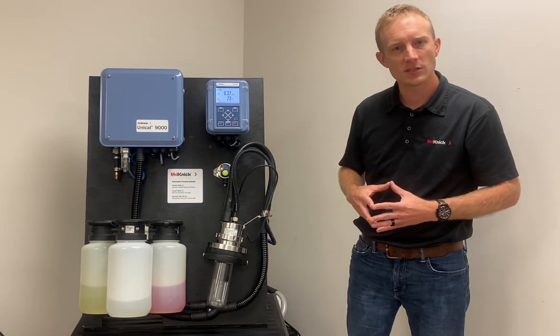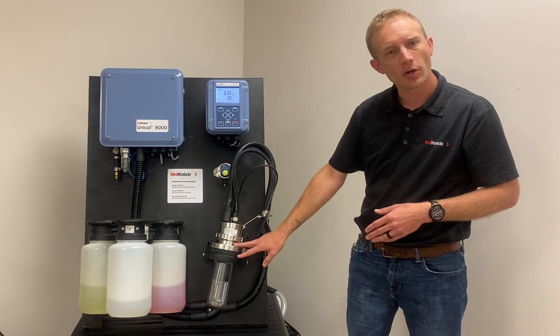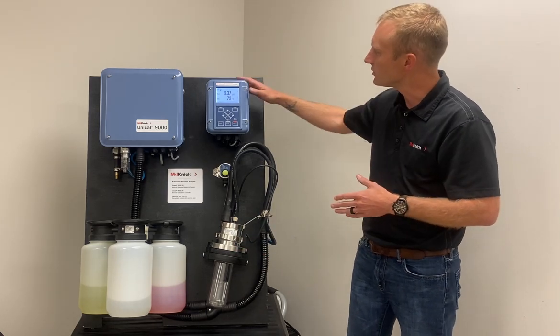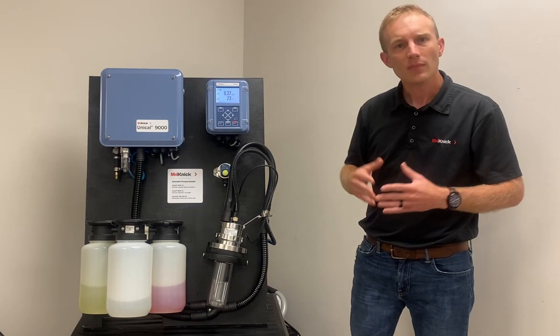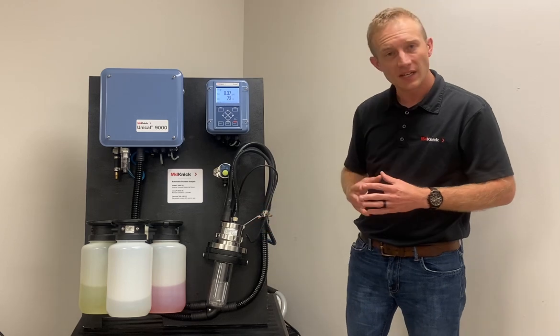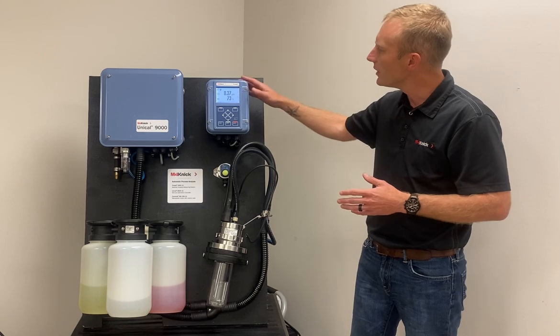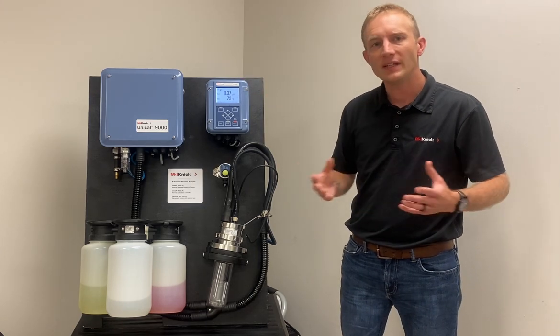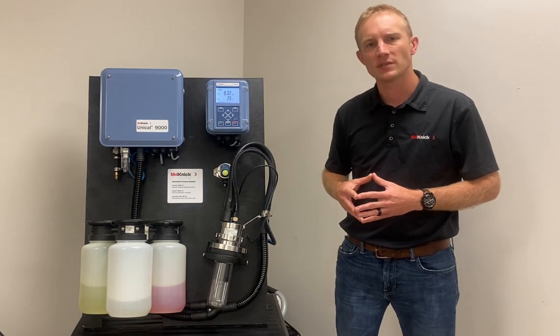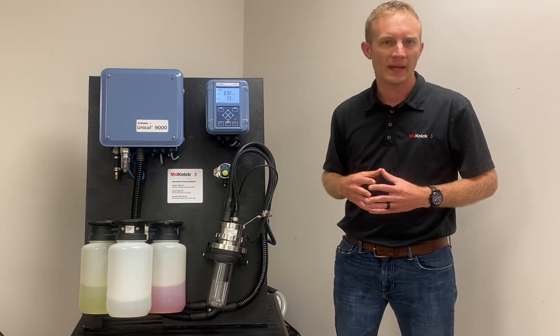We're utilizing a MemoSense pH sensor, and our cable is run from the sensor — which is installed in our retractable holder — to the whole brains of the entire system, which is our Protos transmitter. The Protos transmitter is designed to communicate with both the sensor as well as the Uniqal 9000 control box, and it's here that we house up to seven different unique programs for the automation of the complete system. Those programs include things like cleaning, single point calibration, two point calibration, and a park program.